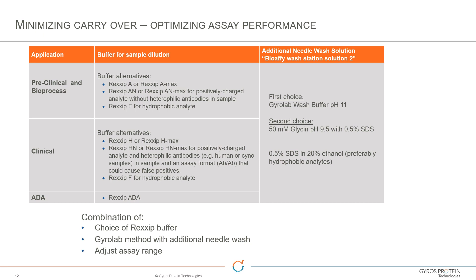One other thing to consider in addition to choosing the right buffer and second wash solution: you may want to think about adjusting the assay range. If you're hitting the system with huge levels of analyte that aren't providing any analytical benefit, you may be contaminating your instrument unnecessarily.